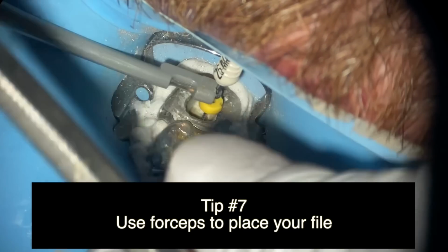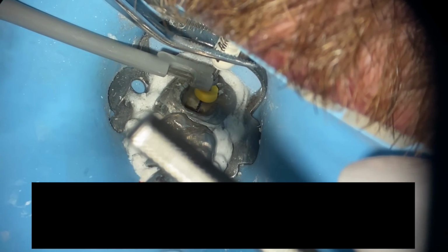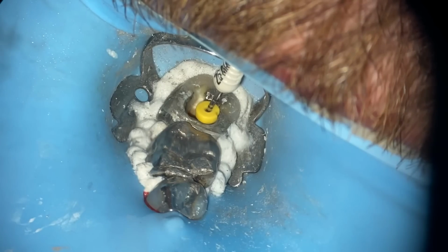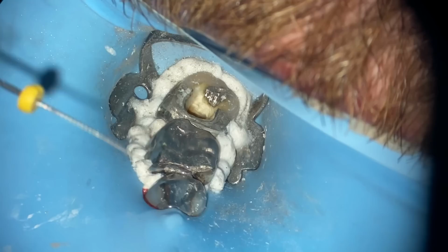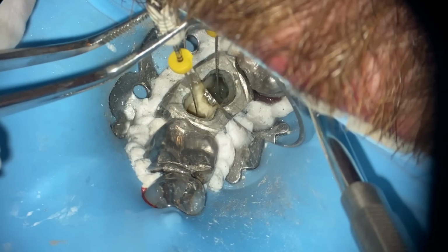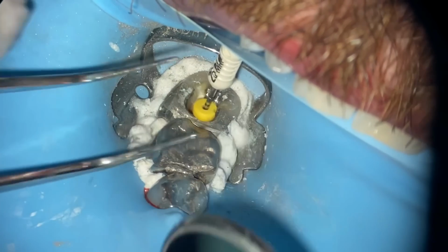So what I've done now is we've fast forwarded to a different place in the video. I'm going to use my cotton forceps to help maneuver that file around and actually help take that file in and out. So you'll see here I'm going to measure. And then what I'm doing is I'm placing my file in with my cotton forceps. It makes life so much easier.